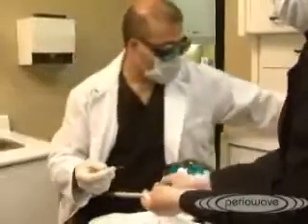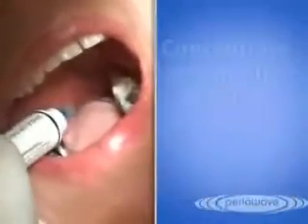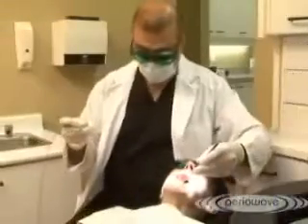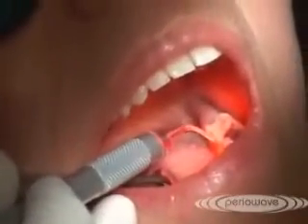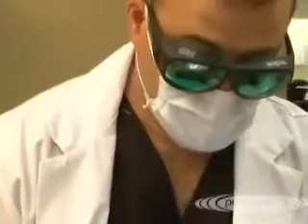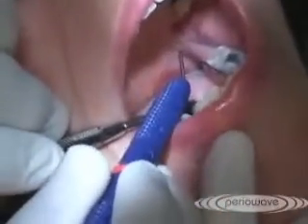The purpose of this is to eradicate and destroy a lot of the bacteria before they enter the bloodstream. We want to make sure that you instill enough of the photosensitizer down into those deep pockets, and we concentrate on one site at a time. Once enough photosensitizer has been placed, we go ahead and place the diffusing tip down at the base of the pocket, and we gently and ever so carefully move that wand. A very quick kill, timed at 60 seconds. If you recall the amount of bleeding we had prior — after pre-treatment, we can see that bleeding is greatly reduced. And that is how fast PerioWave works.